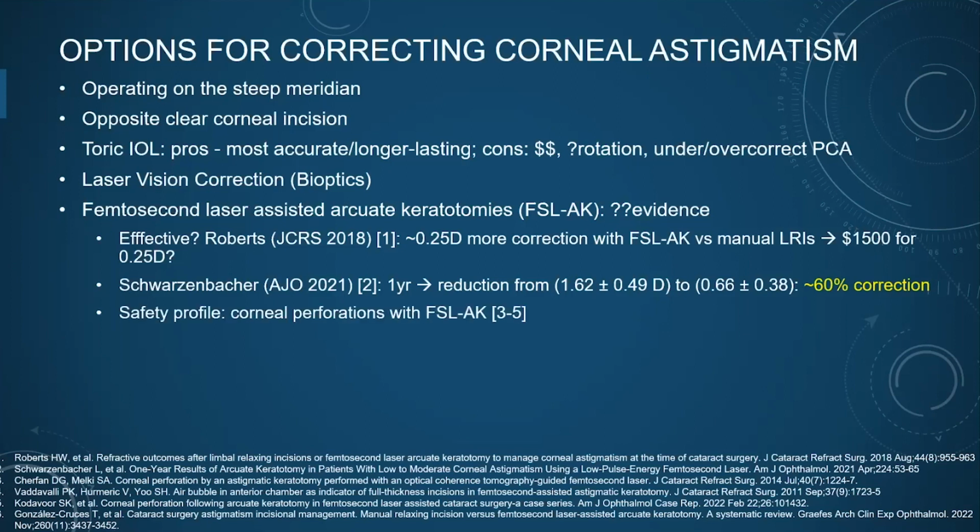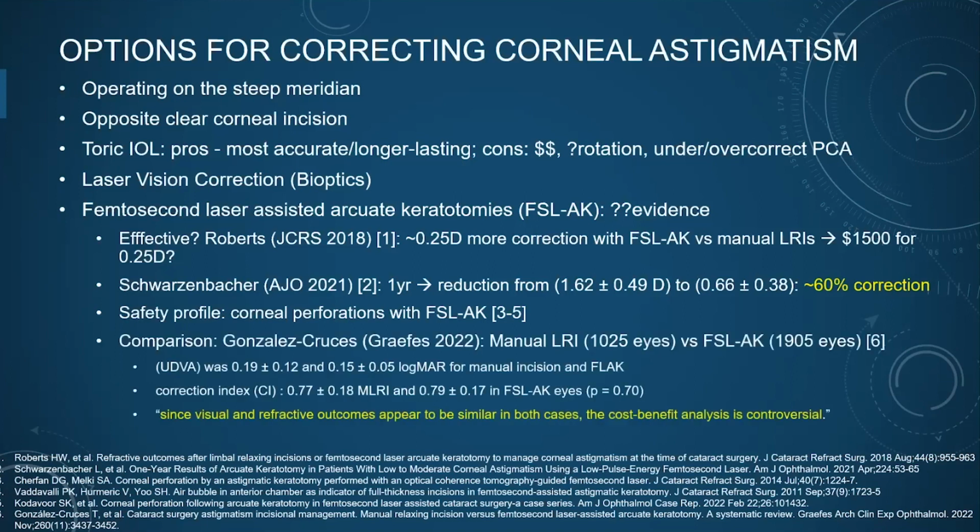People worry about what if you perforate the cornea with limbal relaxing incisions? Well, certainly that's been reported with femto AKs as well, and you can see the references there. But recently, there was a big comparison, a meta-analysis with a large number of patients, of manual LRIs versus femto LRIs, and you can see the numbers there. I won't bore you with all of those numbers, but basically it's very underwhelming.